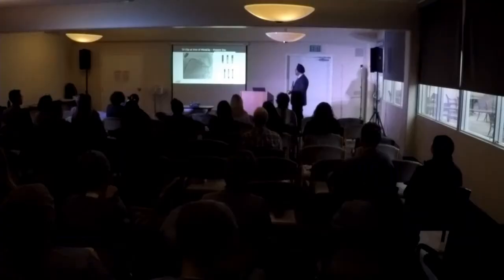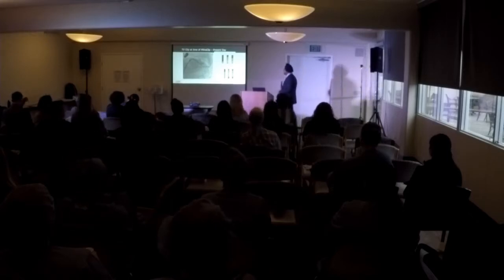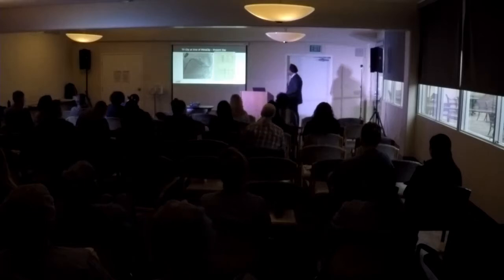We took these patients from severe to moderate, and you would never accept that in the mitral position, but in the tricuspid position, we were pretty happy with it. But look at this, patients actually did better. These are patients with class 3, class 4 heart failure symptoms, and there were a lot more patients improving just by cutting the TR grade by one. Patients actually did a little bit better, and they felt better.